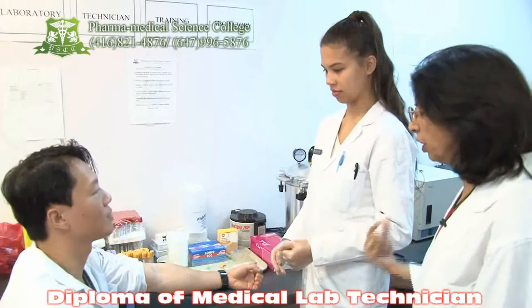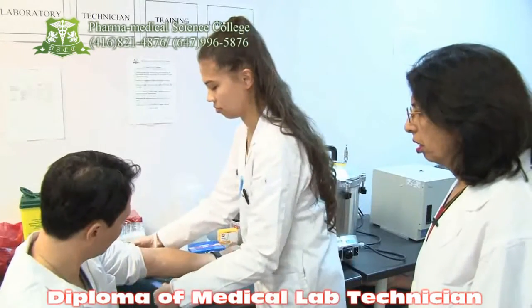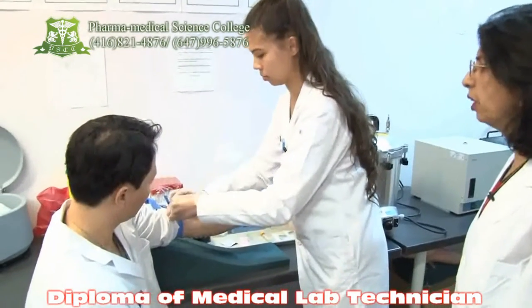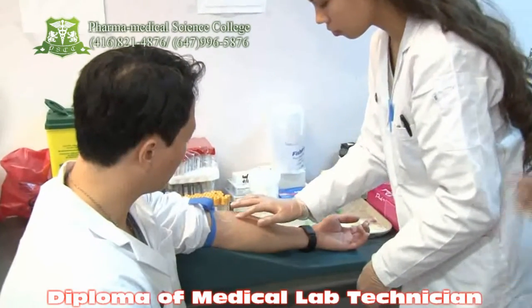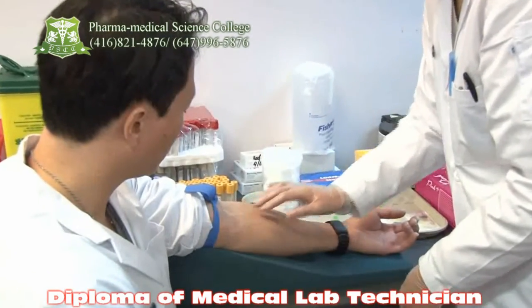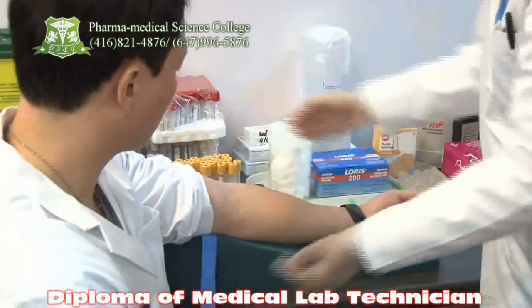Now the technician is going to tie the tourniquet and locate the vein. The vein has to be located by palpating it, by touching it. That's done. Take out the tourniquet and now she will do the cleaning process.